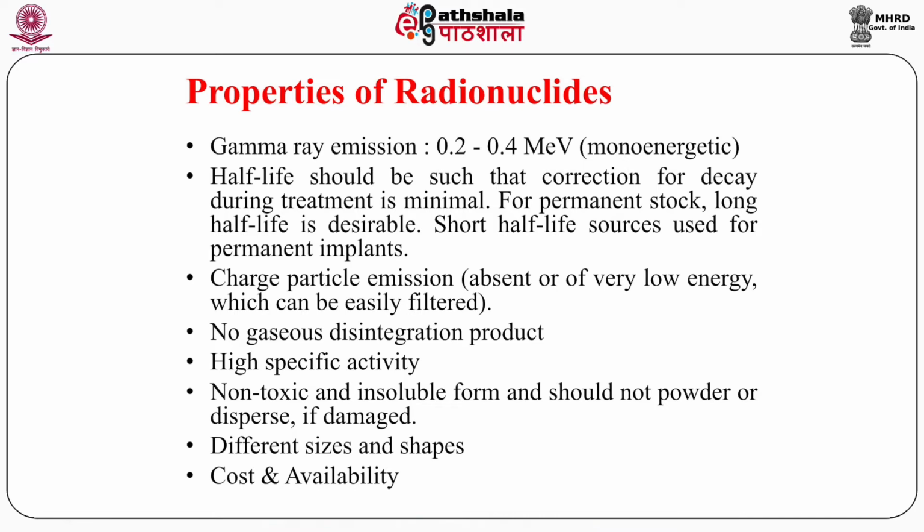For permanent stock, long half-life is desirable. Short half-life sources are used for permanent implants. Now, if half-life is very short, then we have to replace the source very frequently, and during treatment also the correction is required. So the sources which are used should have sufficient half-life, a long half-life, so it can be used properly. Its calculation is much better. Planning can be done in a proper way.